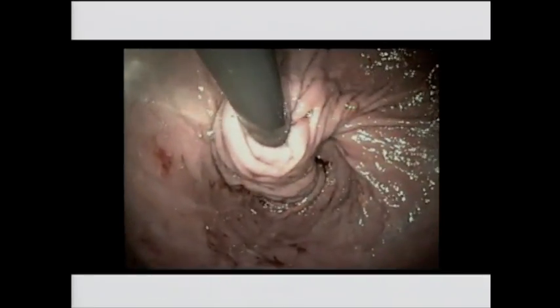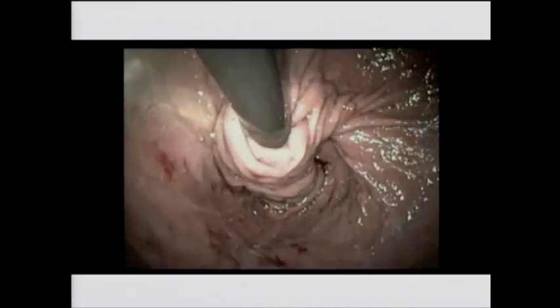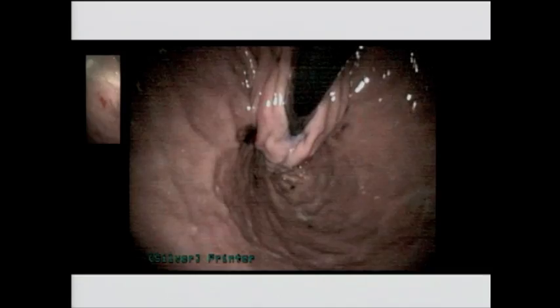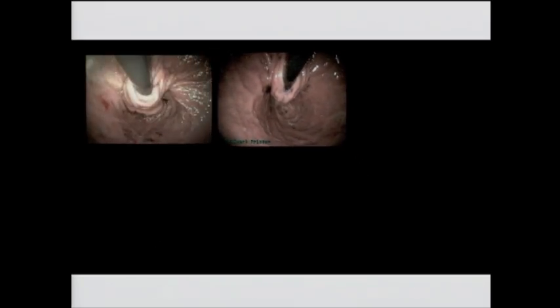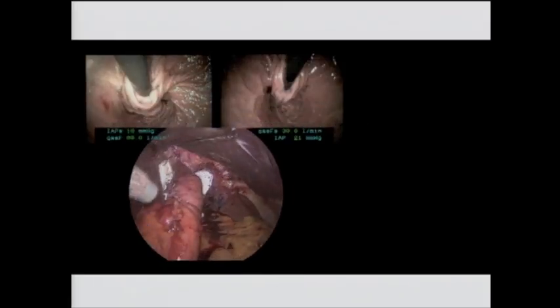If you follow this technique, you can create the same calibrated fundoplication as somebody with far more experience than you have. And really, to me, if you have a way of doing a fundoplication, but only a handful of people can properly perform it, well, it might be good for you in your practice. It's not great for patients as a whole. So I think the real benefit of this technique, if you look at this last video, is that that's Michelle's, and then up comes the one I submitted for the top 21, and those are really pretty similar looking operations. I'd say that's the same operation.